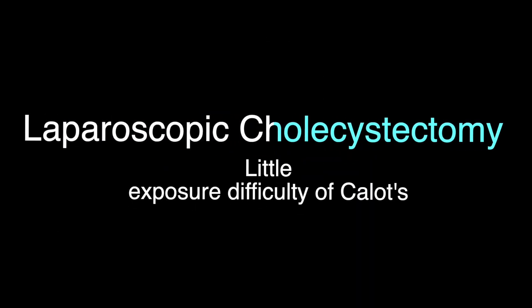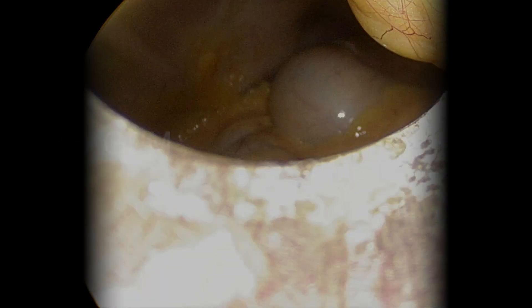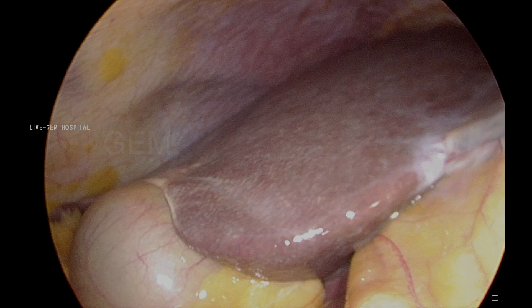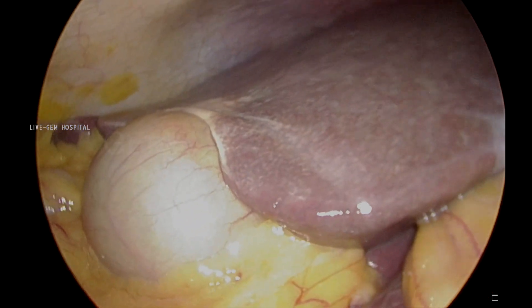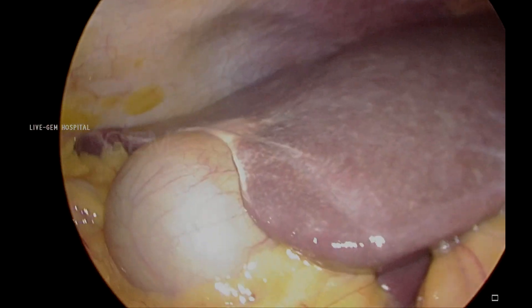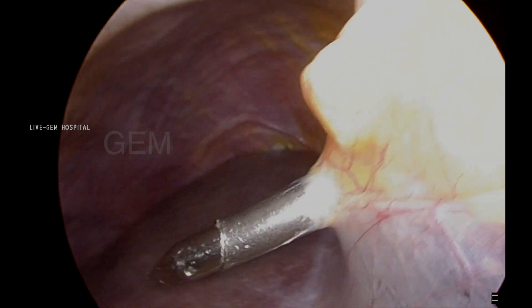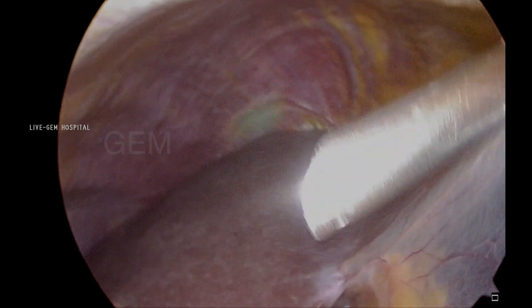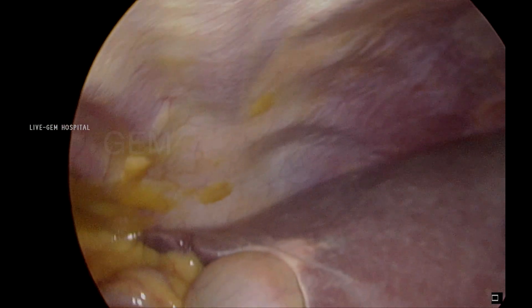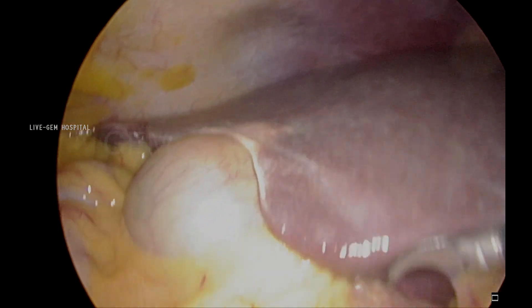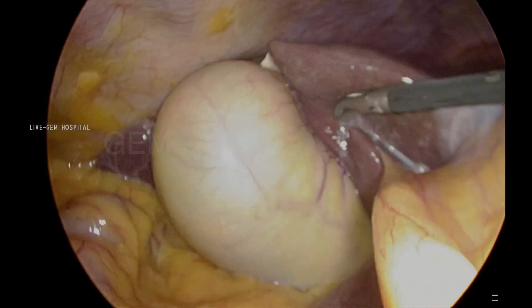Friends, this is the laparoscopic cholecystectomy video — simple gallbladder but with a little difficult exposure on the Calot's. This is the camera port in the supra-umbilical region. The patient is a little obese with a pendulous abdomen, and I am making a 5mm trocar at the inferior edge of the liver, which will give good control of dissection.